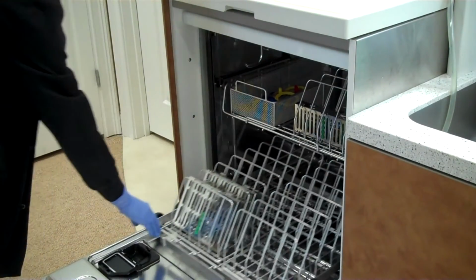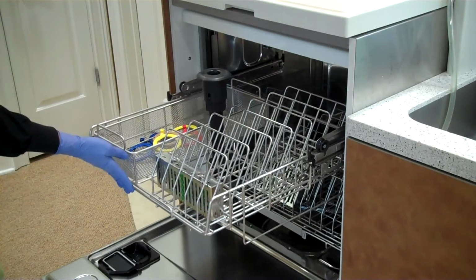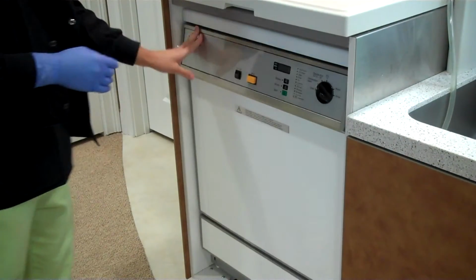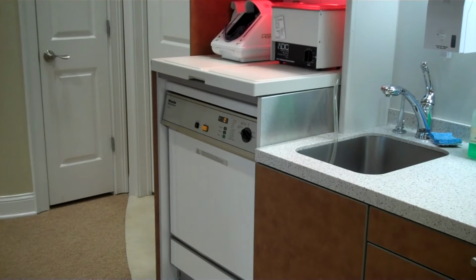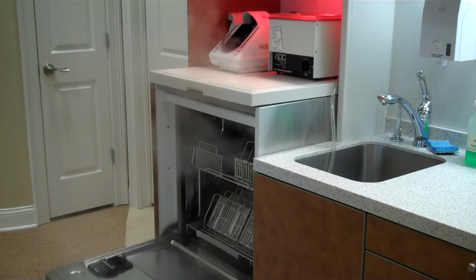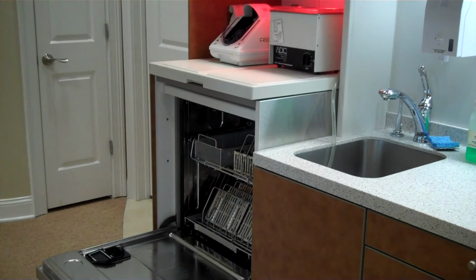Though it may look like just a fancy washing machine, the thermal disinfector is a hospital-grade instrument cleaner. The racks provide places for the cassettes to sit securely, and the basket is used for other instruments. The machine cleans the instruments with a water rinse, followed by an acid and base detergent wash. Finally, the instruments are held at 200 degrees Fahrenheit for 10 minutes. If you happen to see us open the door when it has finished a cycle, you'll notice a fair amount of hot steam coming out. At this point, 99.99% of the microbial load has been removed from the instruments.